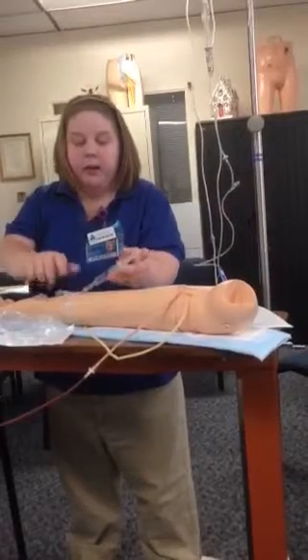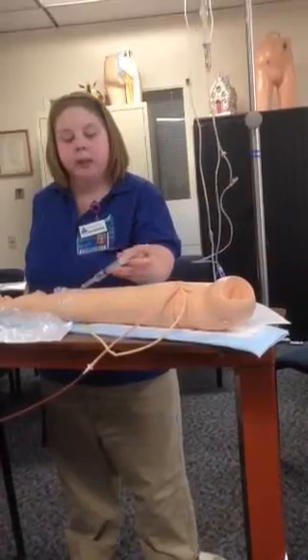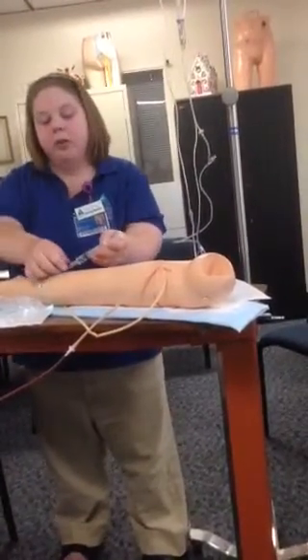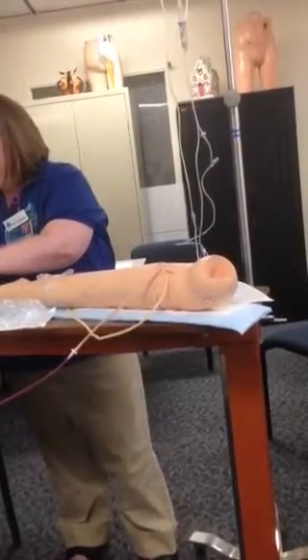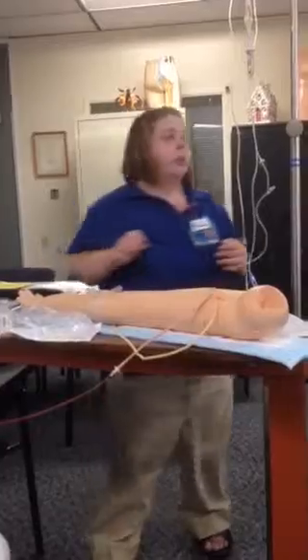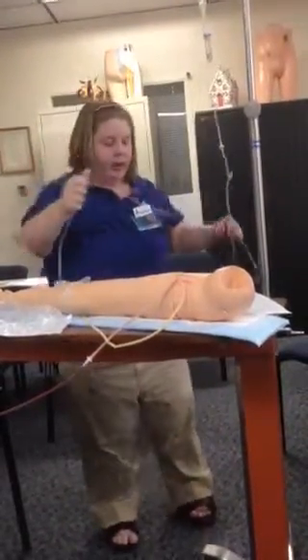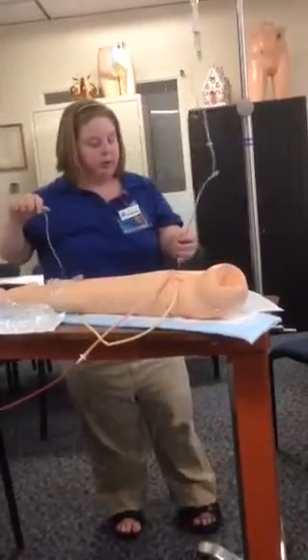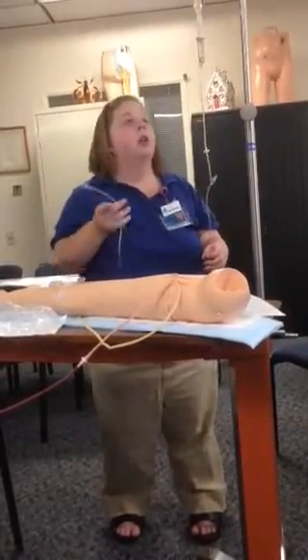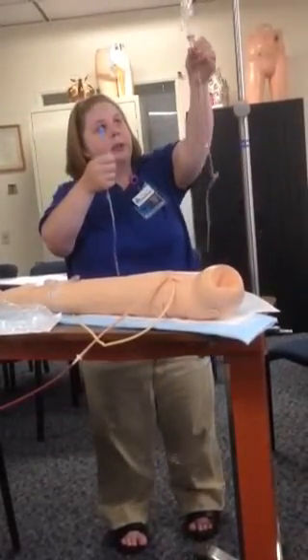I would have had this unclamped. I'm aspirating. I'm going to insert 3 milliliters of saline. Push pause, push pause. Going to unclamp. And I would have primed my tubing, and I would have double checked any allergies with my patient as well. I'm going to unclamp. I'm going to prime my tubing.